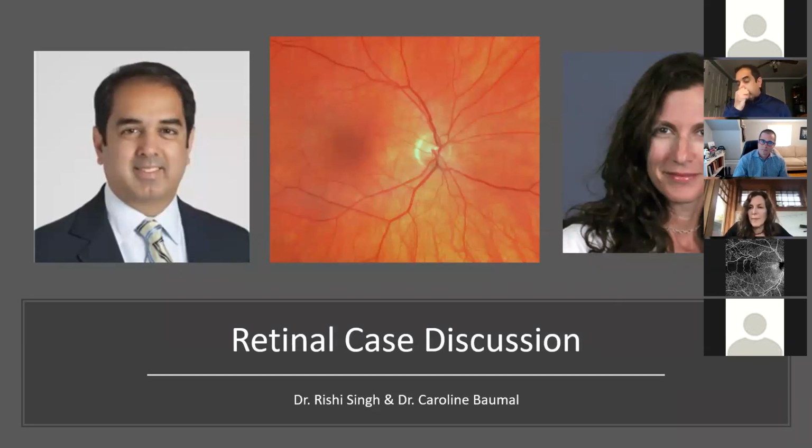So it doesn't do that now, but I think in the near term future, with further development of the algorithm, it is definitely a possibility. So for both, here's a question. When I look at patients, I look at the... Go ahead, Caroline. I'm sorry. Okay, no, I was just going to say, when I look at pictures on patients, I look at the volume, the cube, I look at the one line, I move the line to where I want it to be, and it can take a little bit of time. So if I had a machine that was looking at multiple things at the same time to do that more quickly for me, I'd be very happy. Or an algorithm.